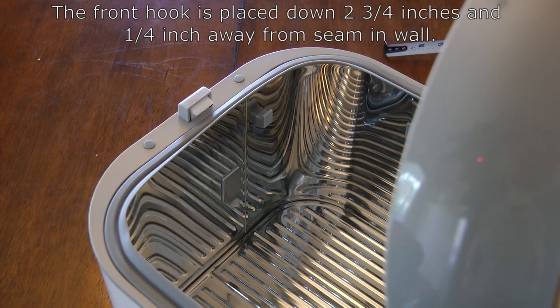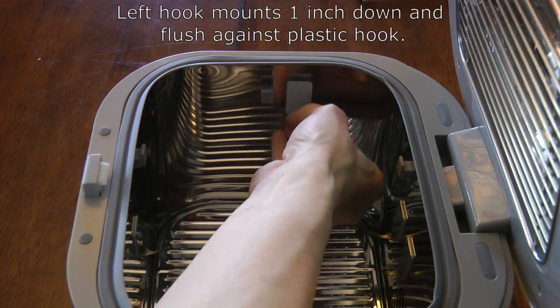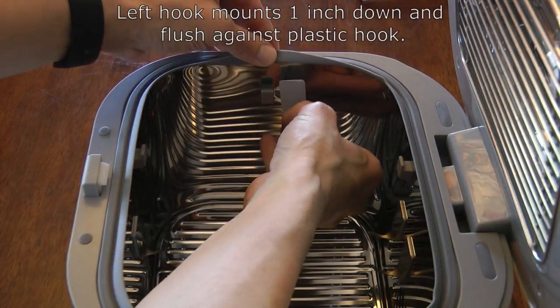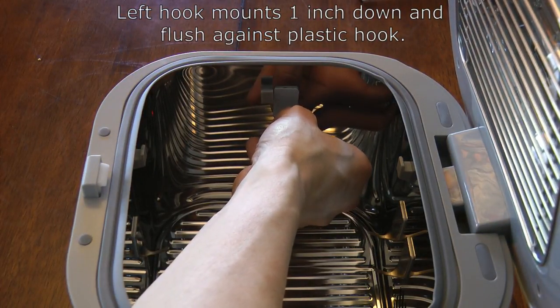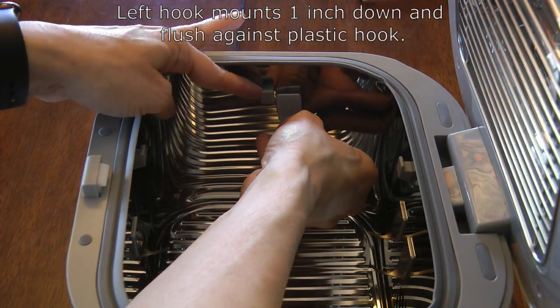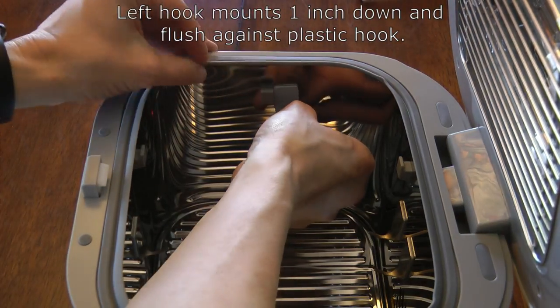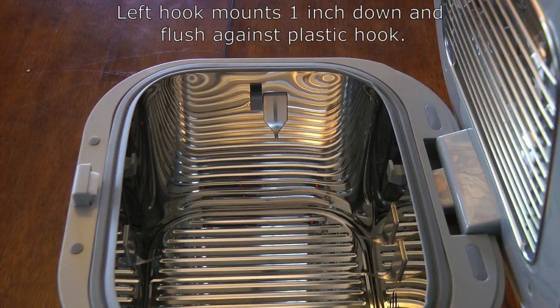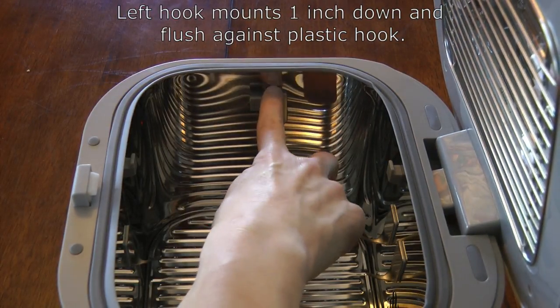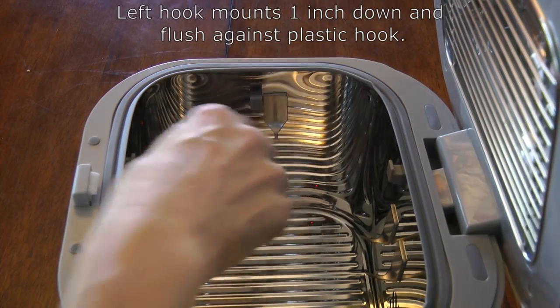Let's look at the left and right sides. On the left wall, we're going to mount one hook one inch down from the lip of the chamber, right up against the existing plastic hook. If you do it right, the top of the metal hook will line up roughly with the little indented part of that plastic hook. I've gone ahead and mounted the hook — it's down one inch and flush up against the plastic hook.